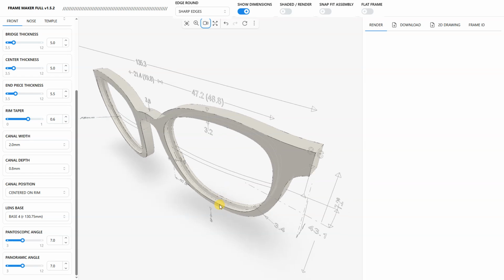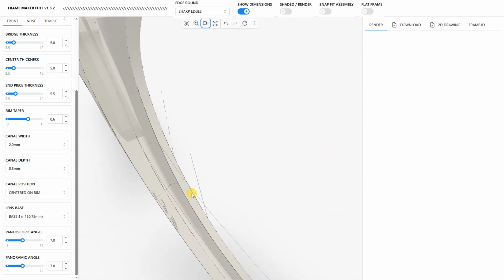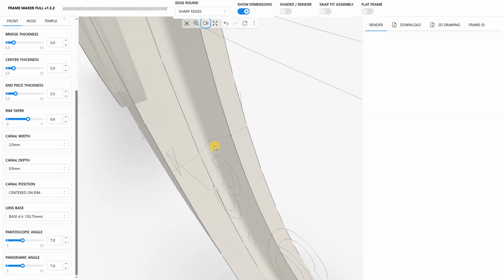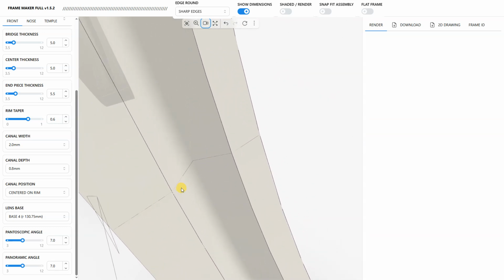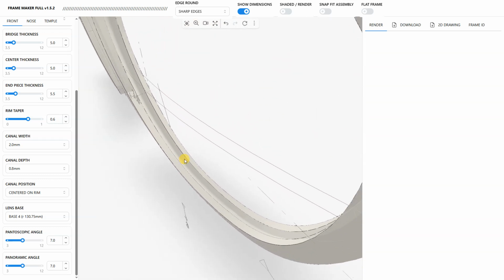By default, it has a width of 2 millimeters. Let's look at it. Here's the cross section, so we can see it more clearly. So from this point to this point, we have 2 millimeters, and by default, we have a depth. So let's say the midpoint between these two would be about here. From there to the vertex, that would be 0.8, as mentioned before. And next is the canal position. So where is that canal positioned with respect to the rim?